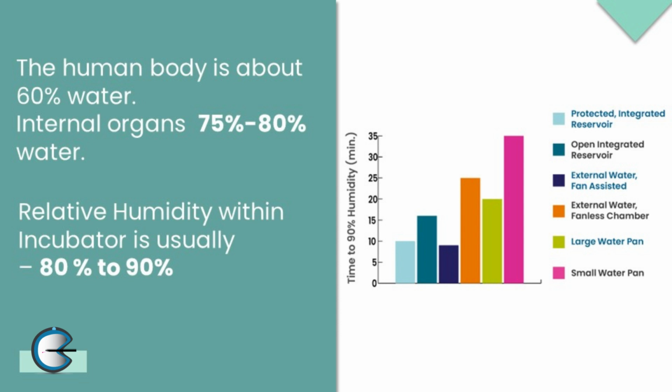So droplet culture without oil overlay is the only one that will be highly impacted by the ambient atmospheric percentage humidity. But I don't think anyone cultures without oil overlay these days, so we can ignore it for now. For box incubators, which are mostly used for equilibration of media, humidity I think is important.